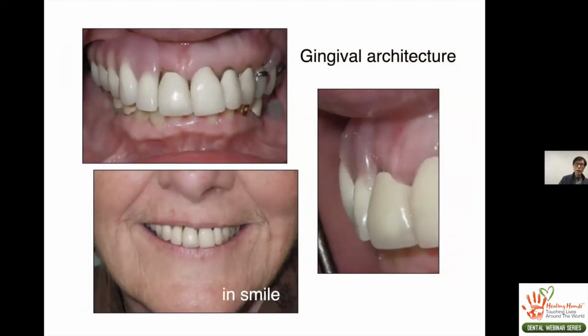And this is what the patient sees, actually. No matter what we do, the patient doesn't know dentistry. They always look at their teeth. And if you look at one side of the remaining teeth, they were covered with PFM restoration, and then we were replacing with denture teeth with partial dentures. So when we have to match plastic and porcelain, that is quite difficult, but luckily it turned out quite well.